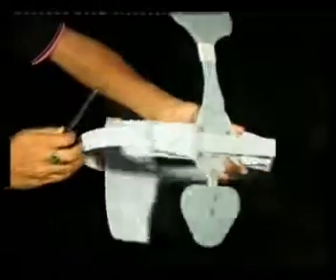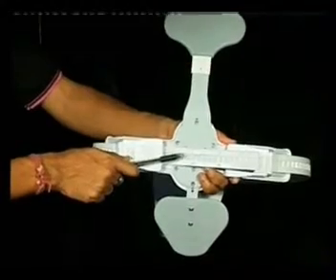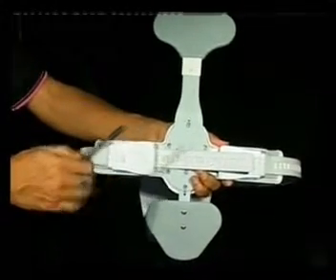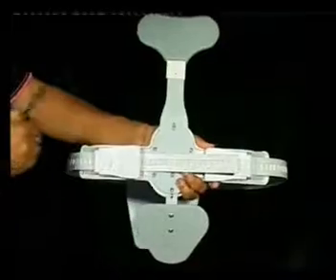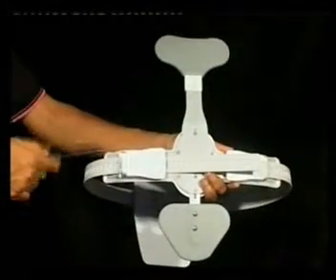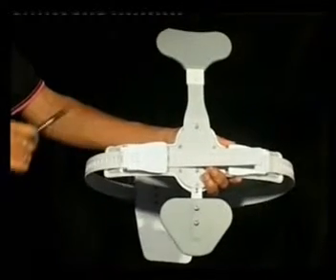This three-point hyperextension brace is used when the patient is bending in the front direction. It pushes the center of gravity of the body in the posterior direction, thereby reducing the tendency of falling of the patients.